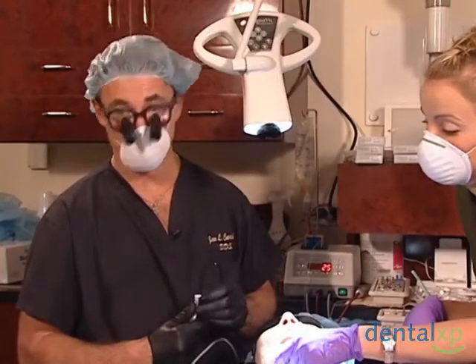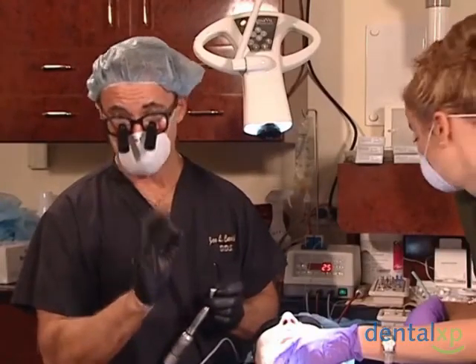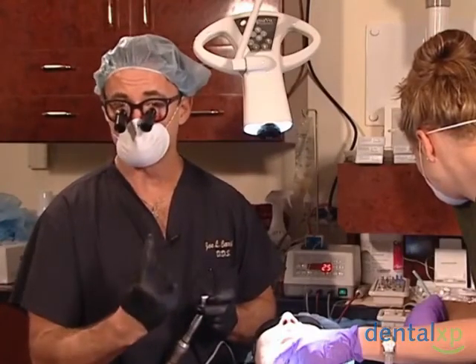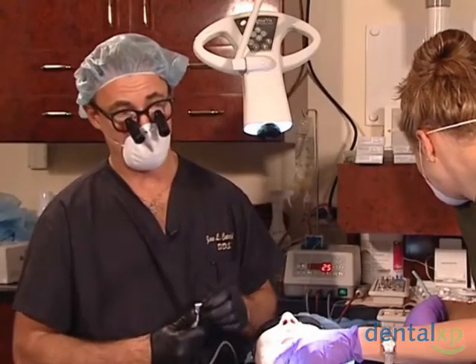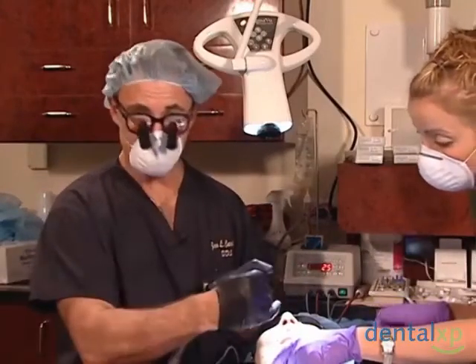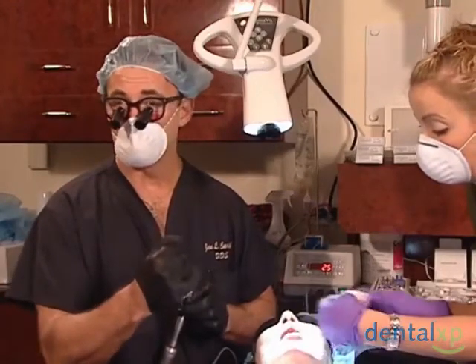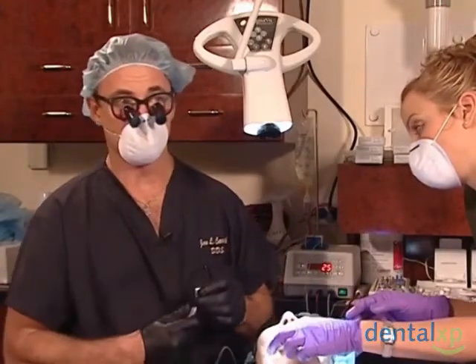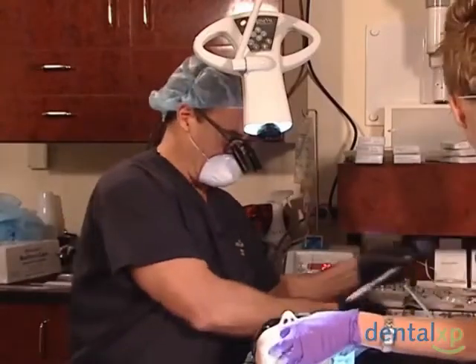So what I'm going to do is remove this implant, go with my 1.6 burr just about 1 millimeter so that I can engage it, because I'm not quite seated all the way, and I'm turning, but I'm no longer engaging. If I continue to do this, I'll strip the area, and then my implant won't be as secure as I want it to be. So remember, what happens here will most likely happen elsewhere. So I'm going to probably go back and see if I can engage the cortical plate on those others. Although I was right at 15 millimeters, it was too dense to engage that last half millimeter of bone. So we'll go ahead and take this out.